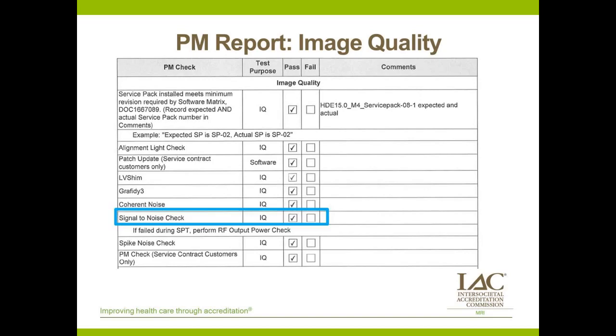One of the things for my own curiosity when I see these types of things is if I see something where the signal to noise value is shown and it's something like 420, and then the spec says signal to noise must be greater than or equal to 35.